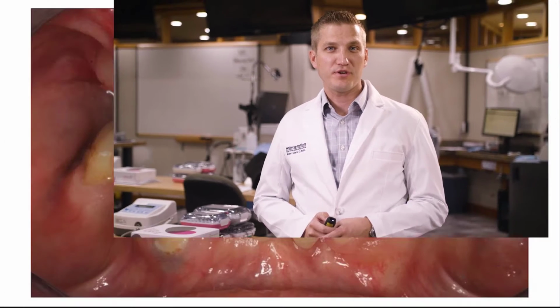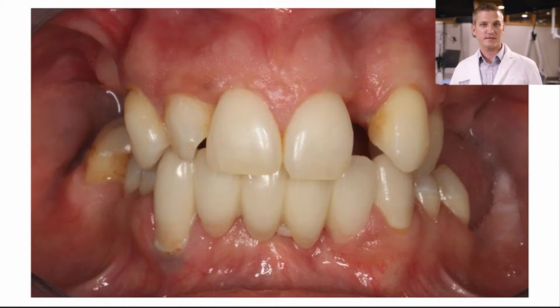All right, now we're going to jump into our actual clinical cases. What I have up here is our very first case. This is a number 10 implant in an edentulous site. As you can see from the profile of the tissues, there is a little bit of a concavity on that buccal surface. Ideally, I would have liked to have done a facial augmentation to create a more uniform look. That unfortunately was not in the budget for the patient. Luckily, the bone that is there is going to work beautifully to get an implant in and still, I think, give us a screw-retained restoration.